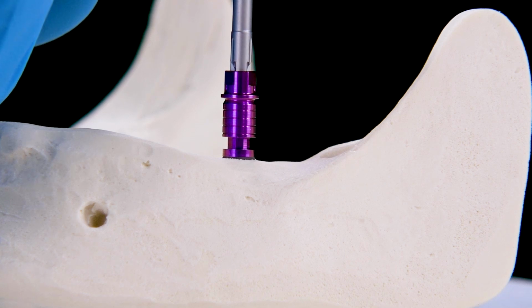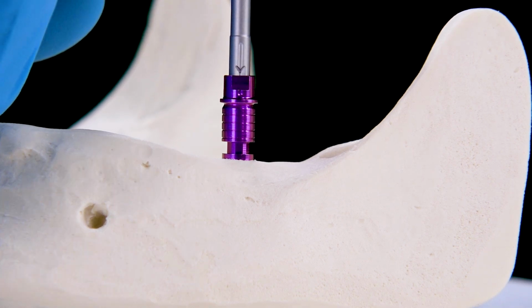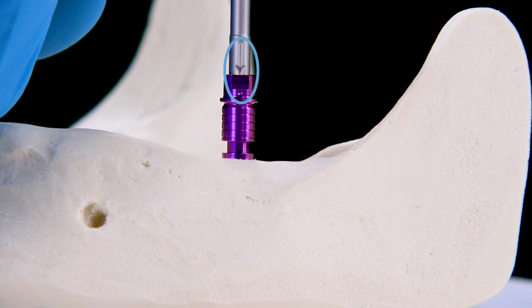When reaching the planned insertion depth, one of the 3 grooves should face in a vestibular direction because the angulation of the abutment starts from a groove.